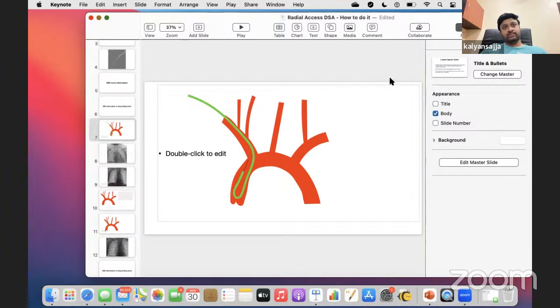I think there is some guy in Paris using an 8 French radial sheath. I don't think it's radial anymore. I've never seen an 8 French radial sheath. So I think he just used the radial sheath and then went up with a FlowGate balloon. Striker FlowGate balloon, you don't need a 9 French like Cello. For Cello, you need 9 French. There is also a smaller Cello, but then it goes through 8 French or 7 French. But for the bigger Cello, the 088 inner diameter, you need a 9 French femoral sheath. But the FlowGate is a little bit easier. You can use a smaller sheath.